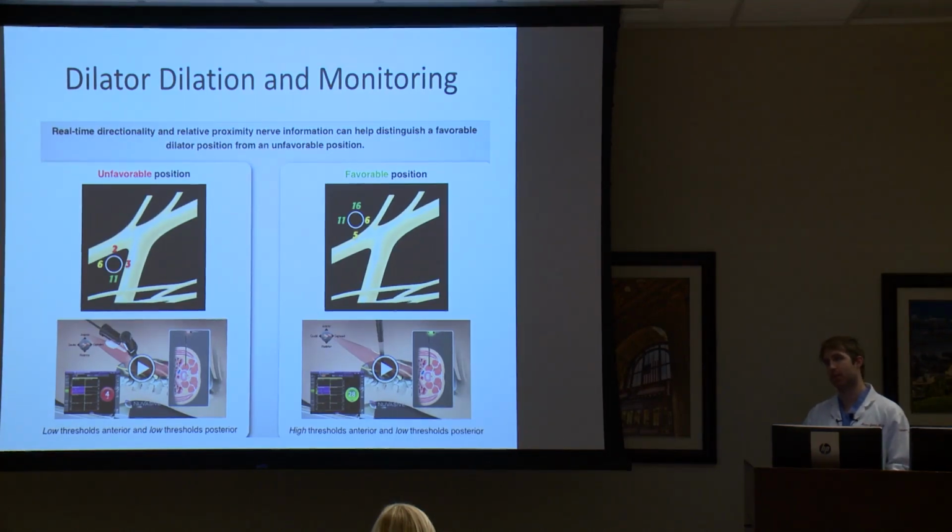The most recent Medtronic retractor that I used was very similar to the NuVasive one. It was really nice. But the one before it was just dog meat. You're like, this is not that great. But we're getting there with other systems. They're all catching up. So either they'll have to lower the price or buy Rhonda something special. So, we'll get there. But I don't use NuVasive here. I use Medtronic. The other reason that you use certain companies is what the implant is itself.